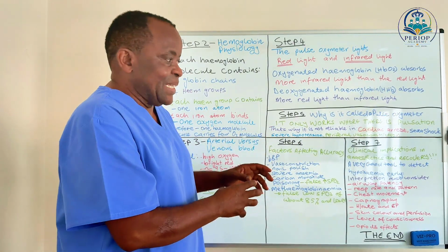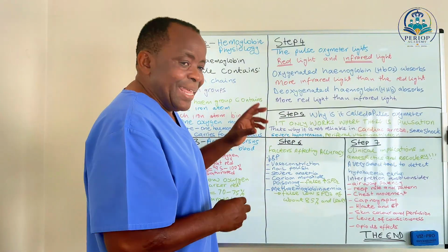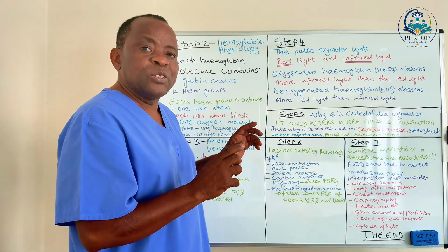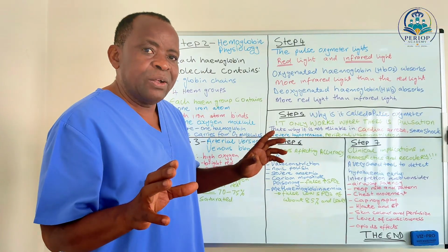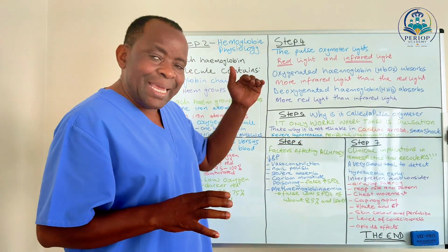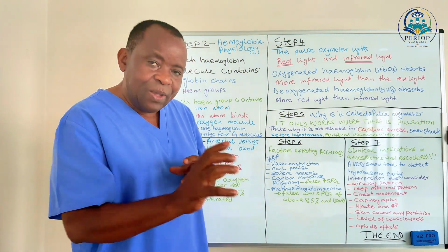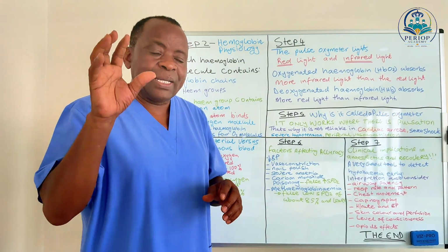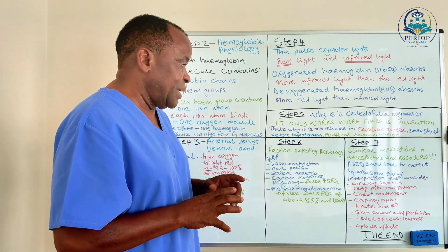Once you understand this is a very invaluable gadget, it is needed almost all the time to make sure that the patient is well attended to, is well oxygenated, and we can translate the values which we are seeing on the screen to the actual clinical patient and take action accordingly.